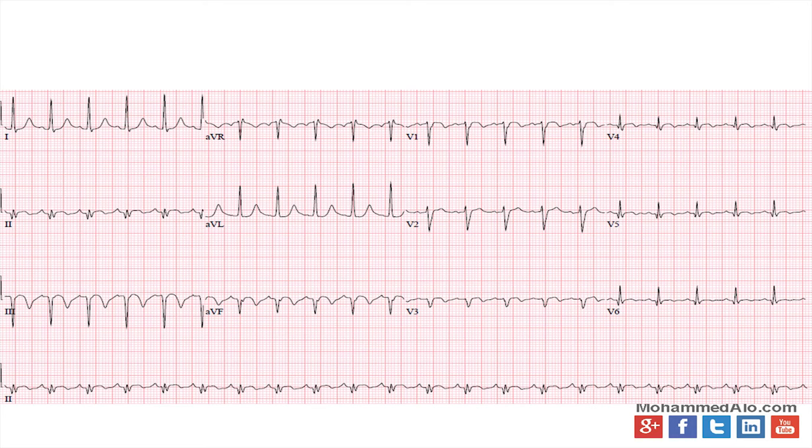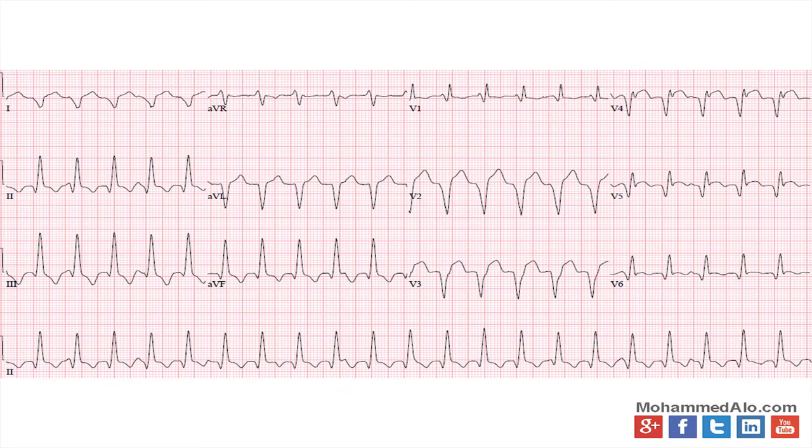The next one here is a little bit on the tachycardic side. There's definitely P waves. Lead 3 looks a little bit funny. Probably a very subtle inferior MI there, more than anything. AVL, which is the usual place it reciprocates to, the ST segment does look a little strange. So I would probably go for a very subtle STEMI in the inferior leads. If you look at AVF, it also looks elevated. Next here is this VTAC, is kind of what the question is going to be.